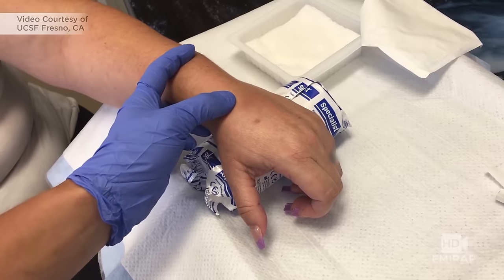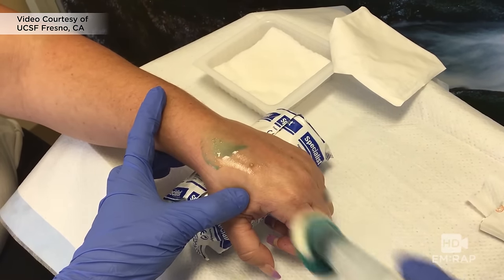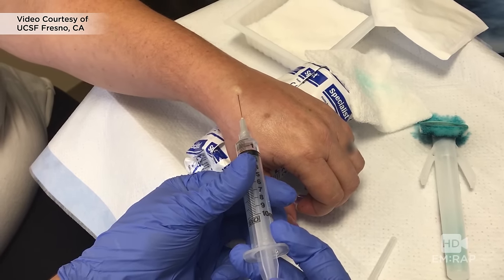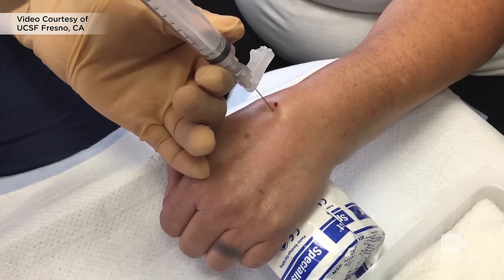Now let's take a look at the real procedure at UCSF Fresno, done by Dr. Dimitrius Deblovsky. Position the hand so the wrist is slightly flexed with slight ulnar deviation. Prep the skin and make a wheal of anesthetic. Switch to a 22-gauge needle about two centimeters long, with the needle perpendicular to the skin.